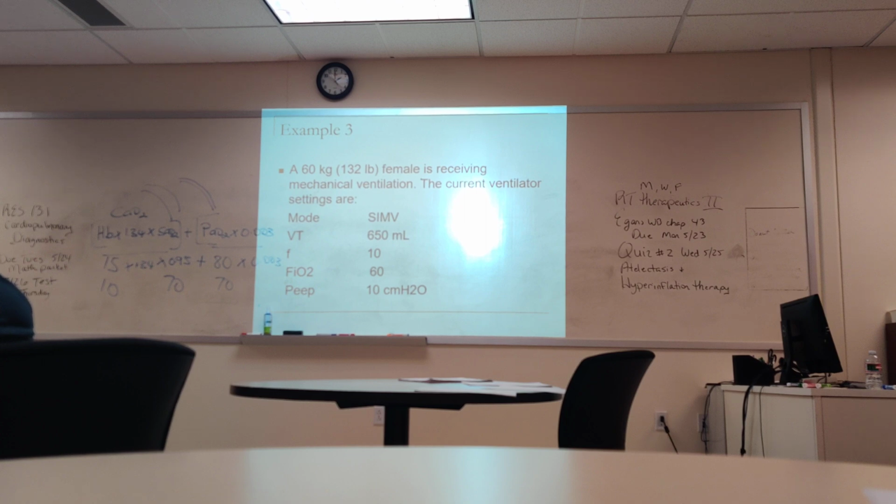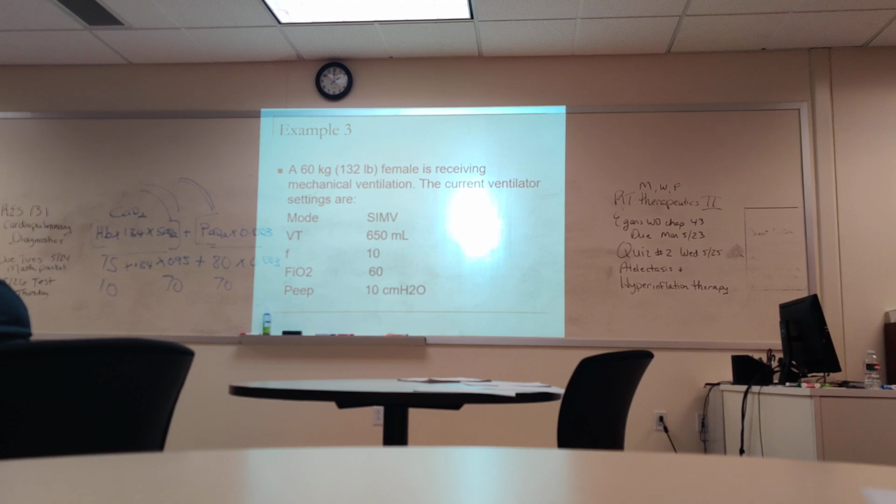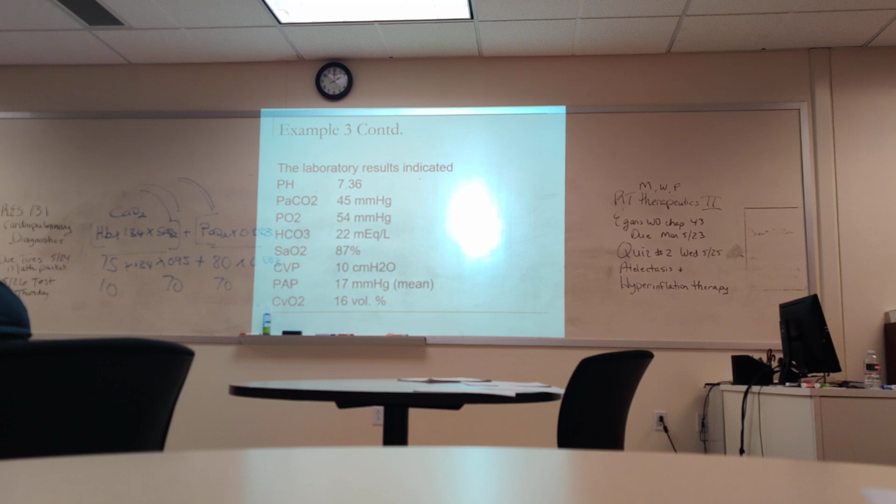Okay, number 3 here. A 60 kg female is receiving mechanical ventilation. The current ventilator settings are tidal volume 650, frequency 10, FiO2 60, PEEP of 10. Here are the blood gases. PaO2 is low. That's the only problem. We have moderate hypoxemia here.